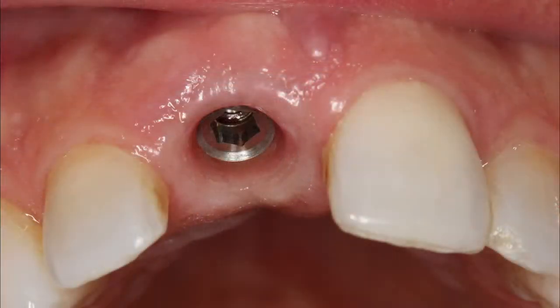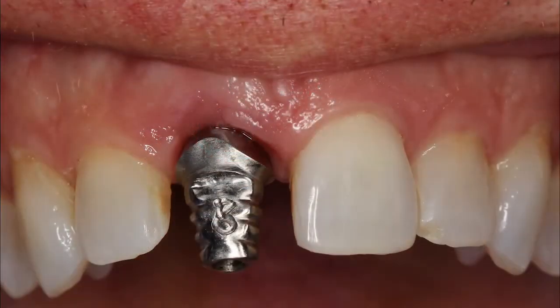The custom healing abutment was removed, revealing anatomically correct contours that would facilitate an ideal emergence profile. The final implant impression, as seen in Figure 18, was made using the custom impression coping, which has the same patient-specific contours as the custom healing components. This allows the lab to accurately design the final crown while accounting for the final soft tissue anatomy.